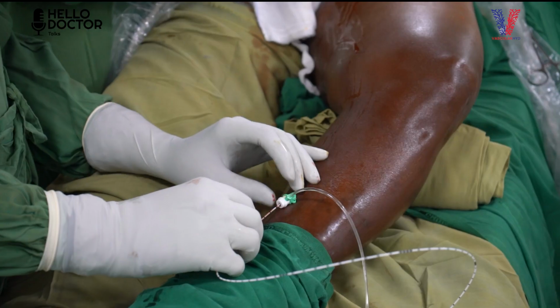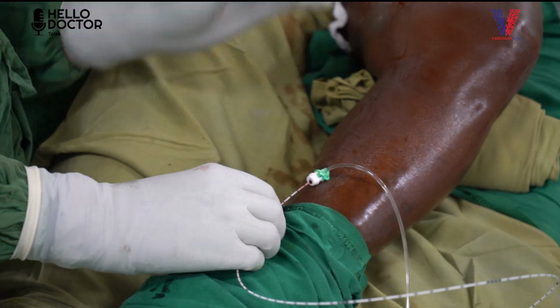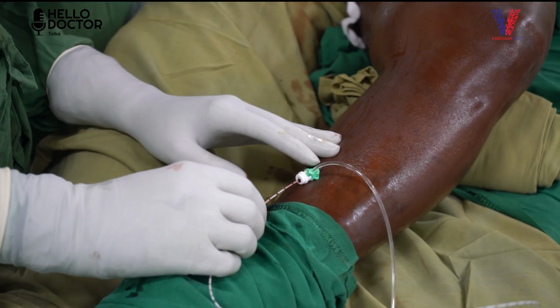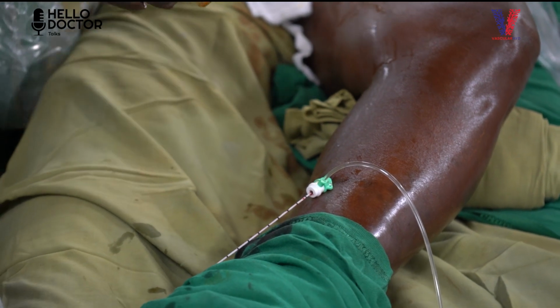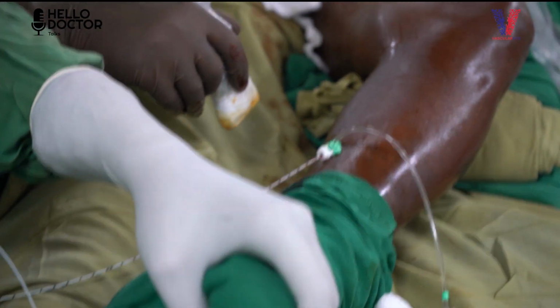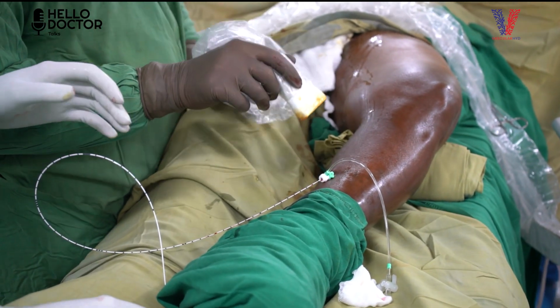We are at the junction. We are pulling back 2 centimeters approximately. So we have secured the position of our fiber tip, and now we don't move the leg or change the position of the table.